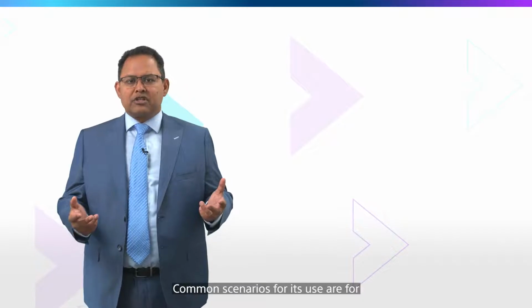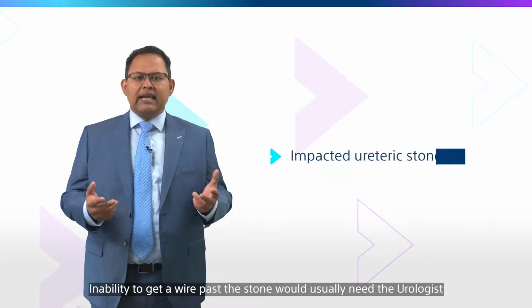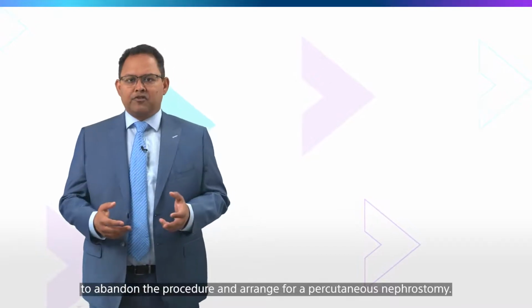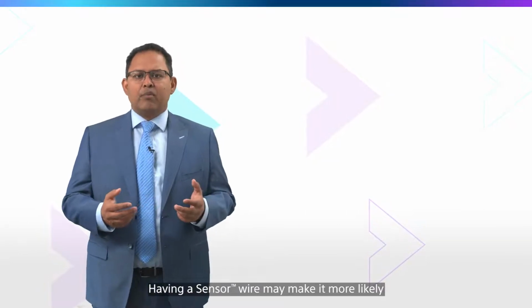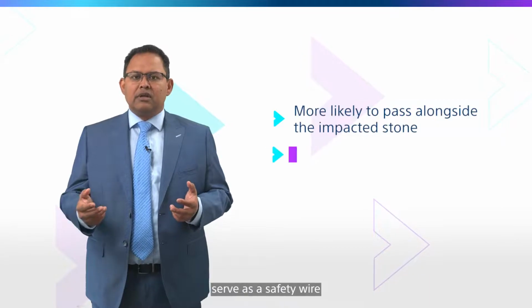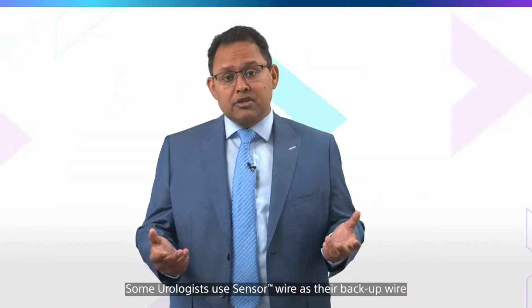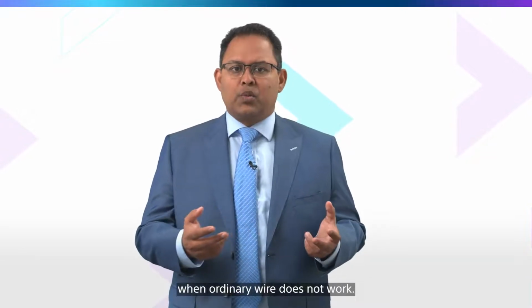A common scenario for its use is impacted ureteric stones during a ureteroscopy. Inability to get a wire past the stone would usually need the urologist to abandon the procedure and arrange for a percutaneous nephrostomy. Having a sensor wire may make it more likely to pass alongside the impacted stone, serve as a safety wire, and carry on with the rest of the ureteroscopy procedure. Some urologists use the sensor wire as their backup wire when the ordinary wire does not work.